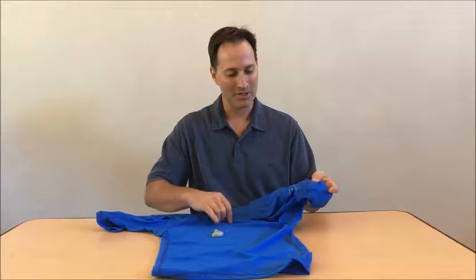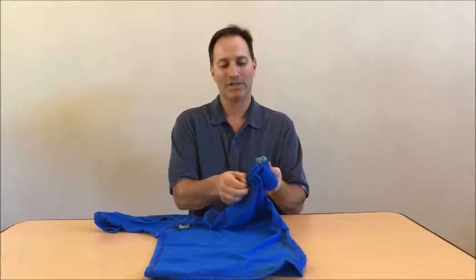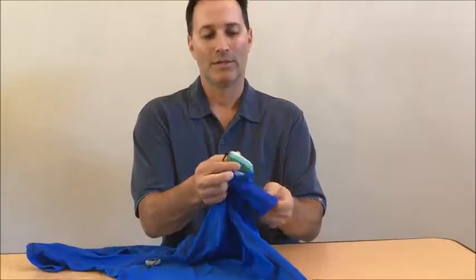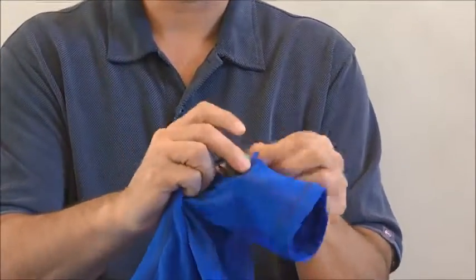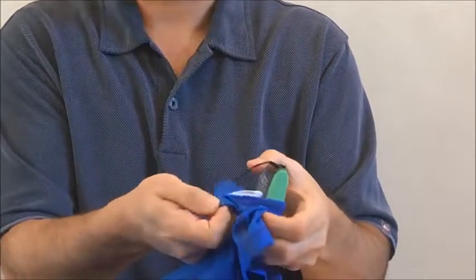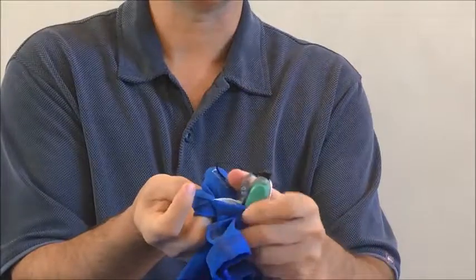I have a processor already rigged up inside one of the pockets here. When you look inside, the processor is already attached to the band, but the real unique thing about the processor going through the shirt is the buttonhole that feeds through the inside of the shirt.